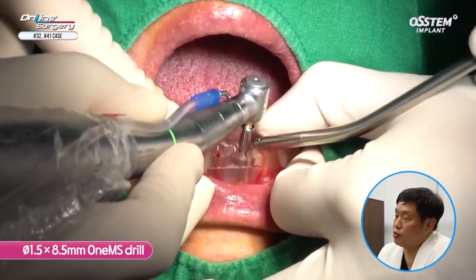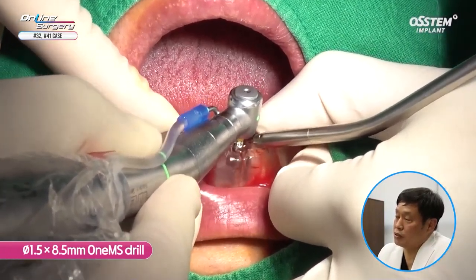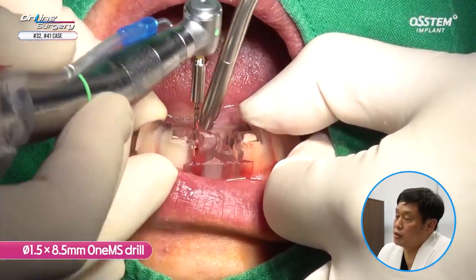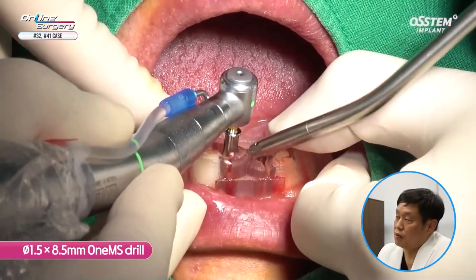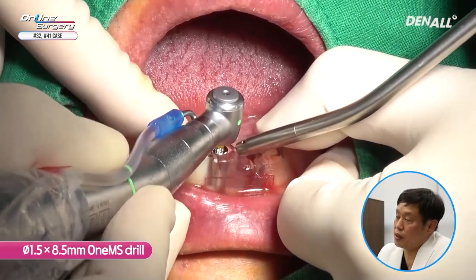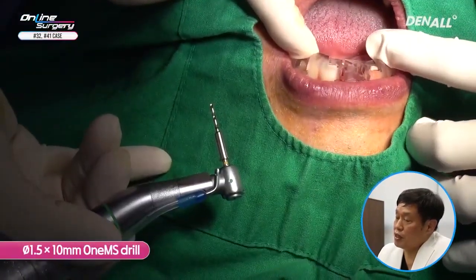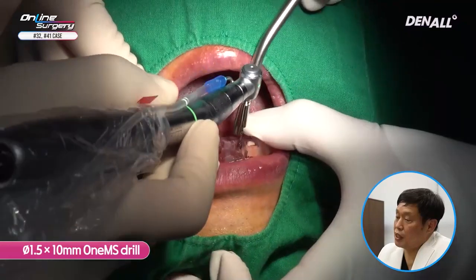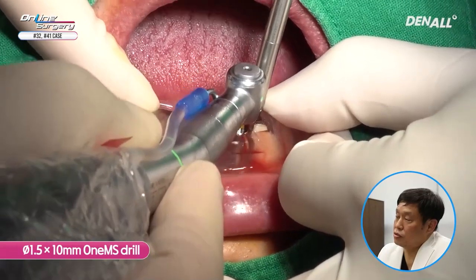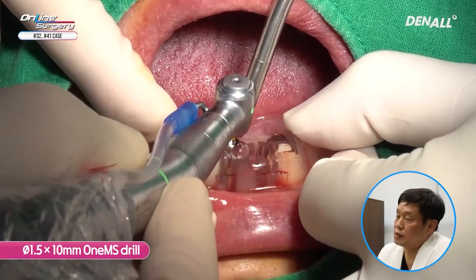Although the final drill is going to be 10 mm, I am going to use 1.5x8.5 one MS drill for double contact. The 1.5x8.5 one MS drill is used for number 41 as well. Initial drilling is done. Because we are going to place a 10 mm implant, I am going to use the 1.5x10 mm one MS drill. I am going to irrigate sufficiently to minimize heat generation as I do drilling.